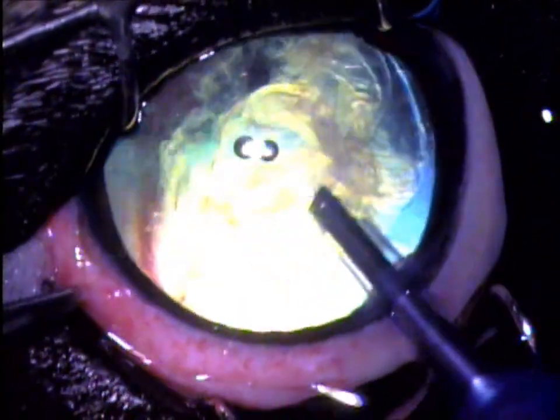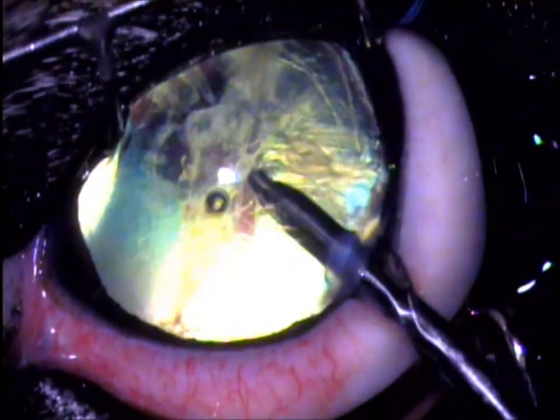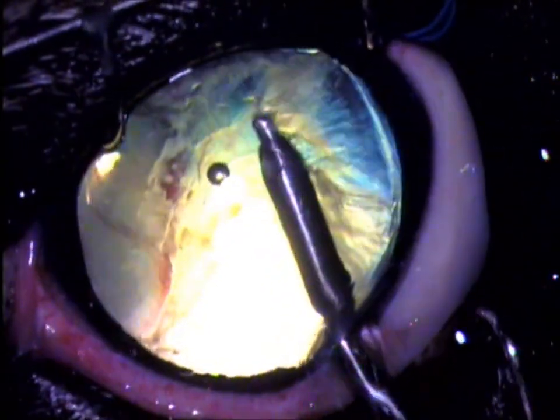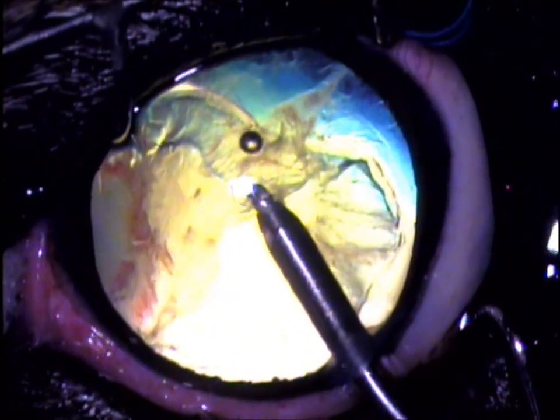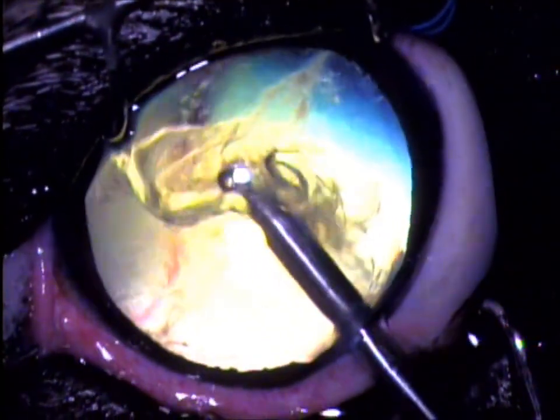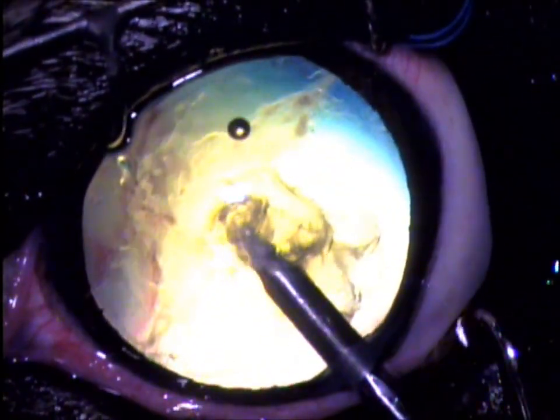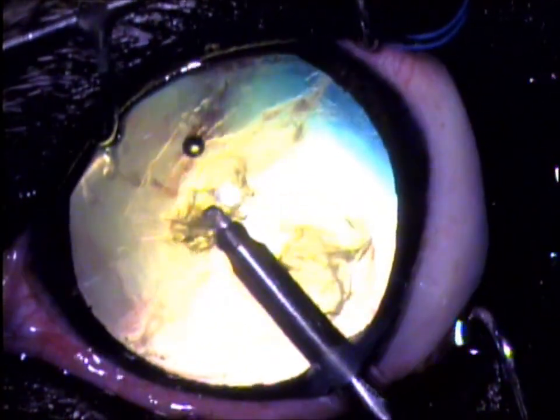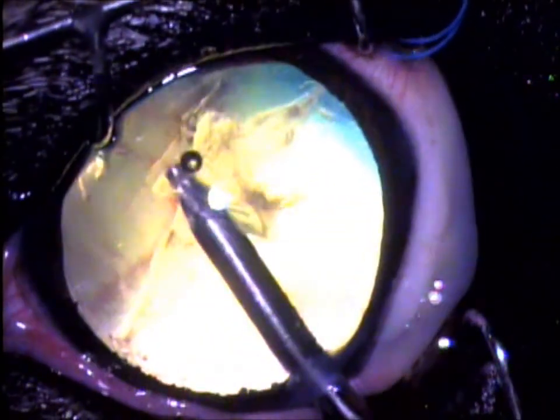Now after removing the harder nucleus of the lens, we have to go back and get the soft cortex. This is almost a jelly-like substance, and it's aspirated or sucked out of the eye here. You can see me peeling it off the posterior lens capsule — this is pretty thick stuff in this dog. And there it goes, being sucked out. Notice in the very back of the eye you can see the red lines — that's the optic nerve and the blood vessels on the retina. Here we remove the remainder of the cortex.